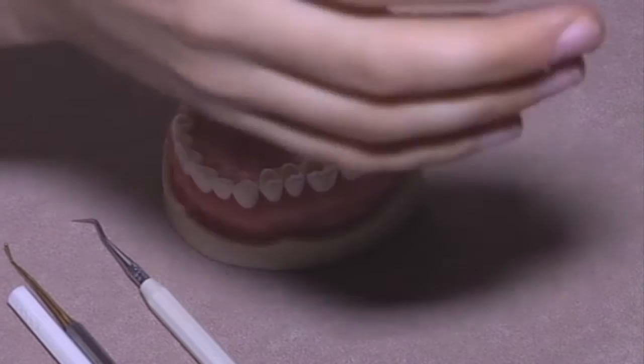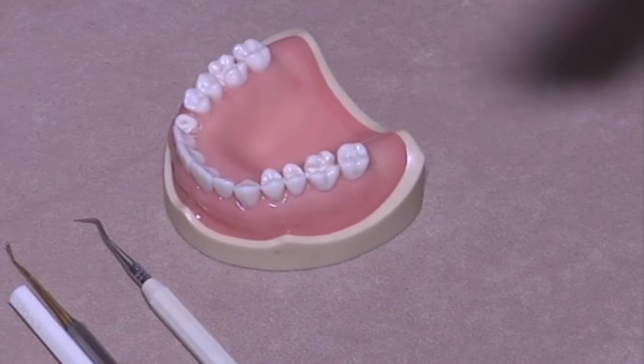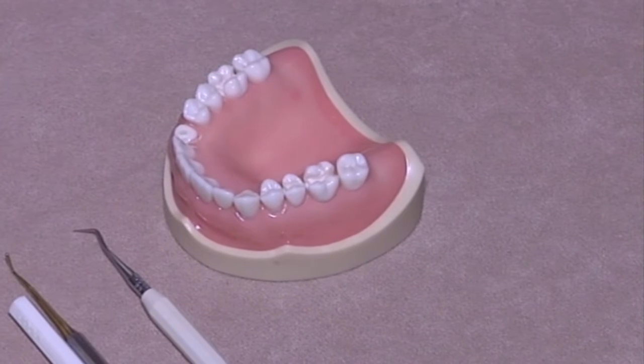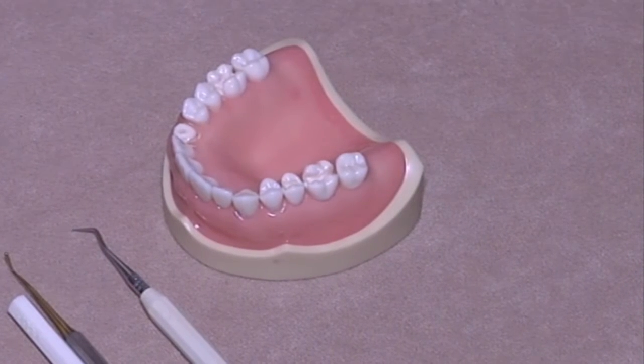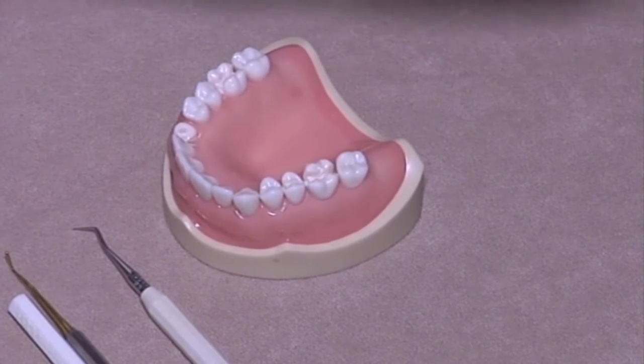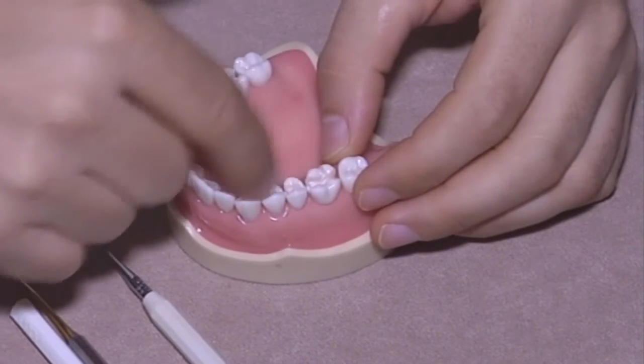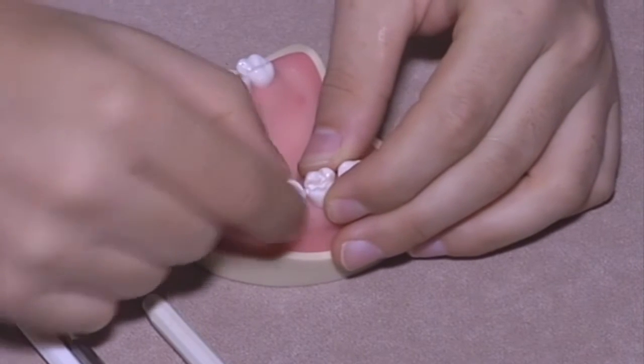So marginal crest, sulcus, fissures, triangular crest, everything. But the color is not the main problem. Consequently, we're gonna do 2 restorations now.